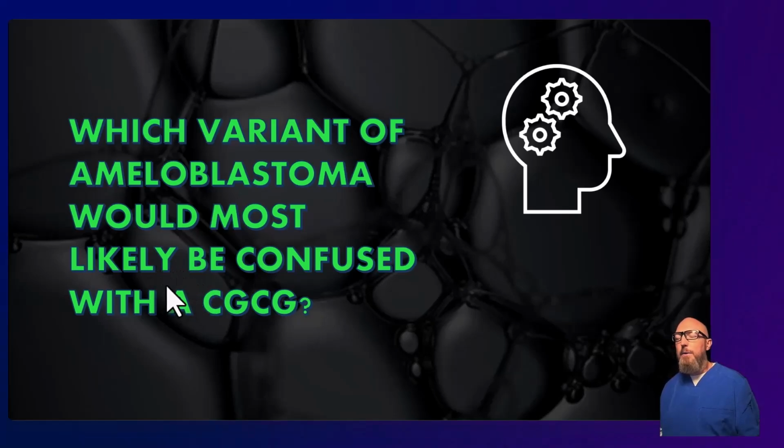And so overall, I would say desmoplastic ameloblastoma, but as far as just the pure multilocular appearance, the multilocular ameloblastoma, the solid type, may be confused with a CGCG. But keep the age in mind too. Age is quite a difference.